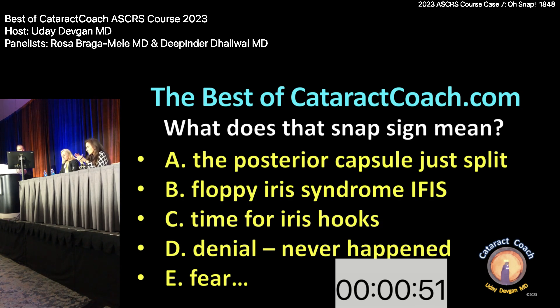It's not floppy iris syndrome — you saw that change in volume. The key is: I love cortical cleaving hydrodissection, going just right under the anterior capsule, but when you see the nucleus coming up you have to blot the nucleus down to let the fluid come all the way around. What about placing the cannula in the middle of the nucleus to prevent it from coming up — would it be better to hydrate to the sides? The problem was injecting fluid and keeping pressure on a moderately dense nucleus without allowing that fluid to go anywhere, so if fluid has nowhere to go, it goes posterior.